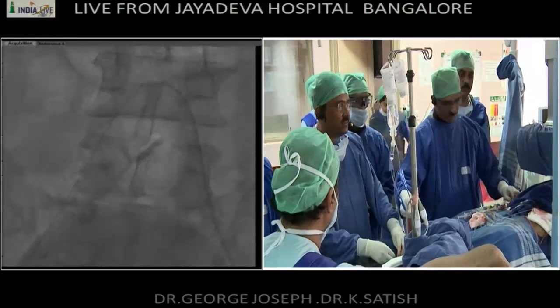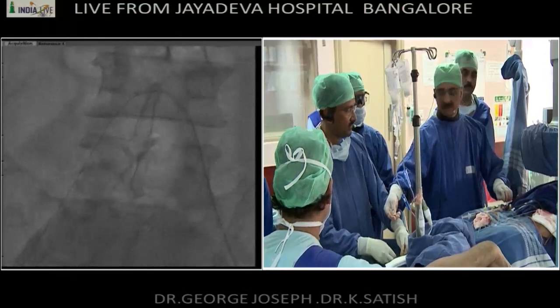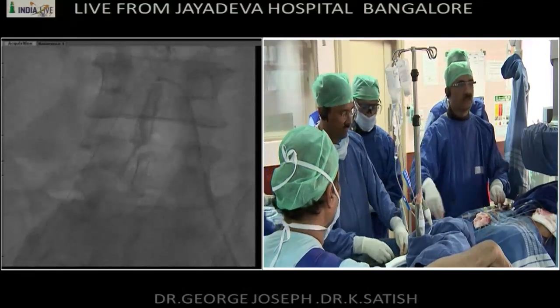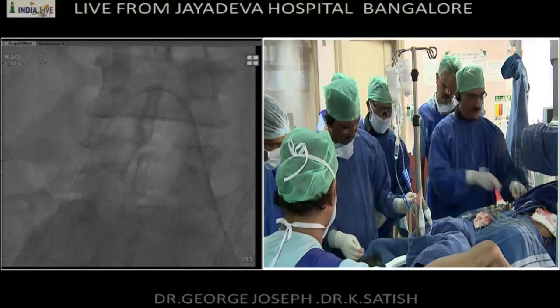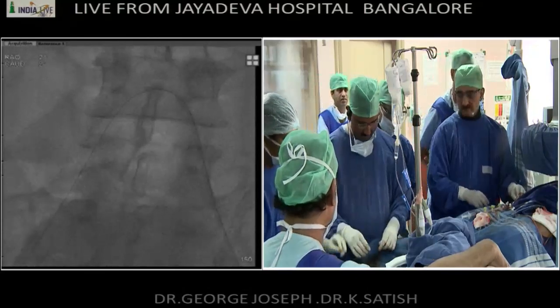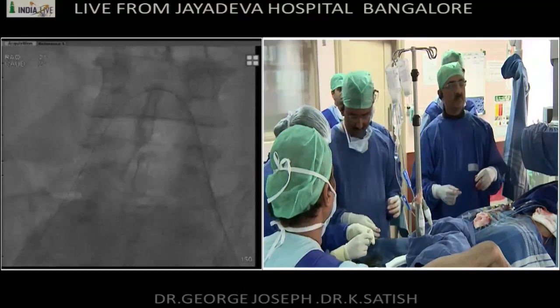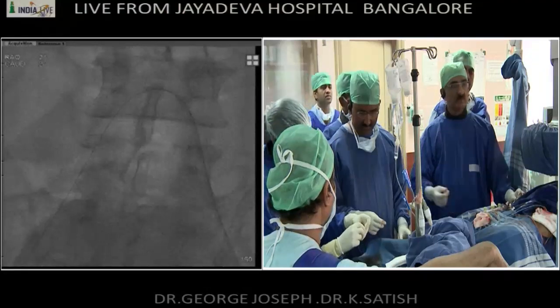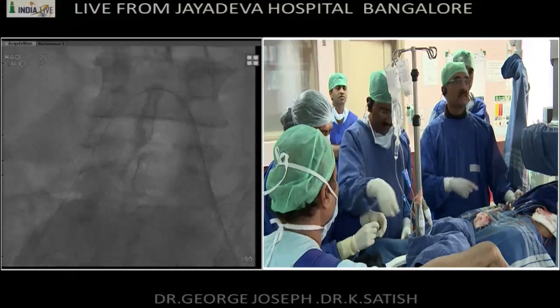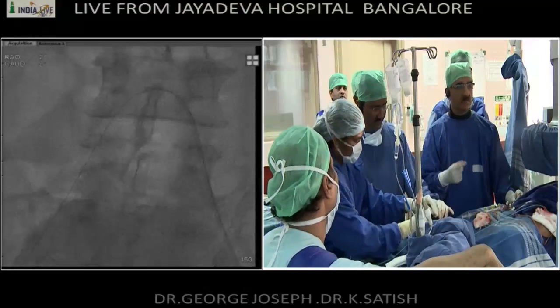Okay, do we have that JR catheter? Just put it on this wire. I think that's enough. We have 100 out. Just see, this 100 will go. So then the next aim is to get wires up into the aorta from both sides. So once this catheter reaches the bifurcation area, I will pass a parallel wire.